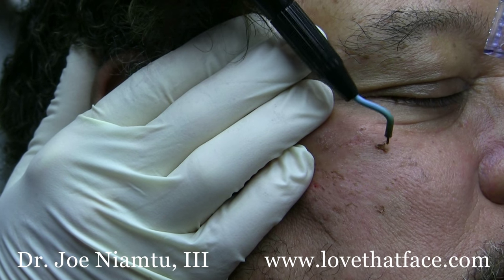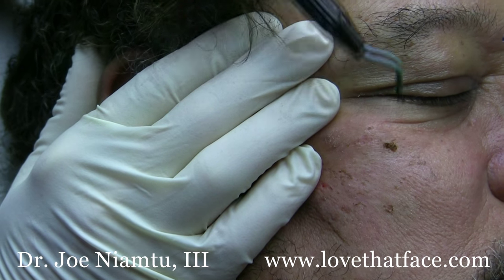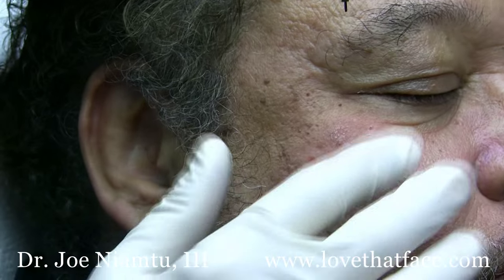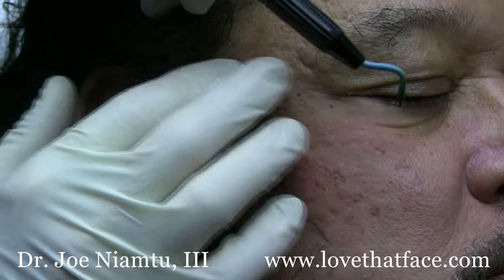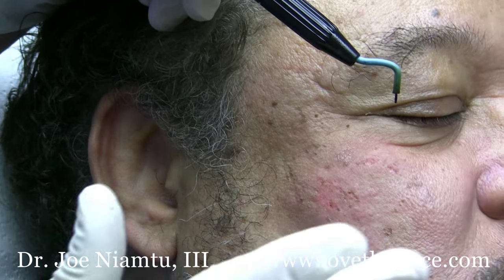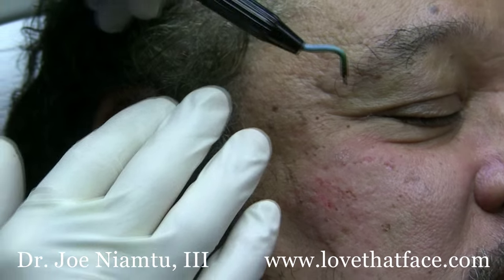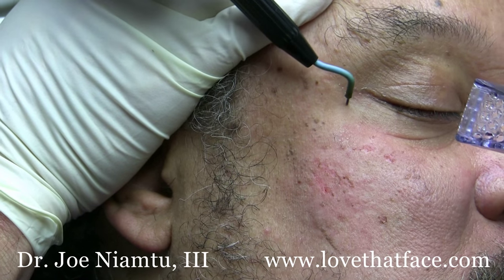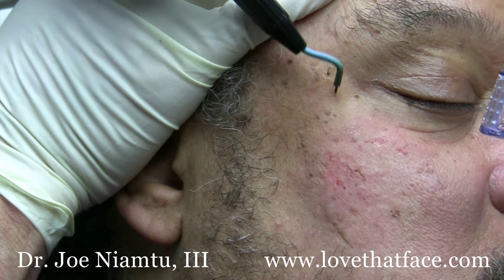Obviously if you're doing this without anesthesia, you want to use the lowest setting you can, which you really want to do across the board with radio wave or electrosurgery. The key is to find a setting where you'll ablate the tissue. If you're sparking, it's too high. And if you're dragging in the tissue or not ablating it, then it's too low.